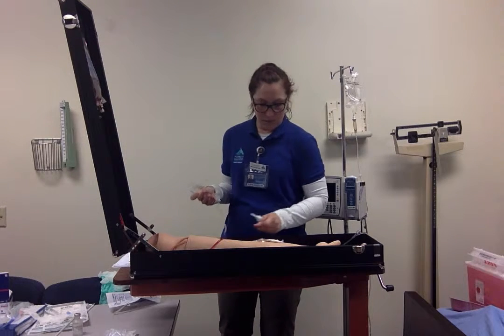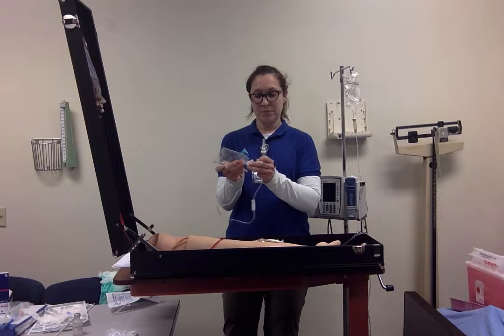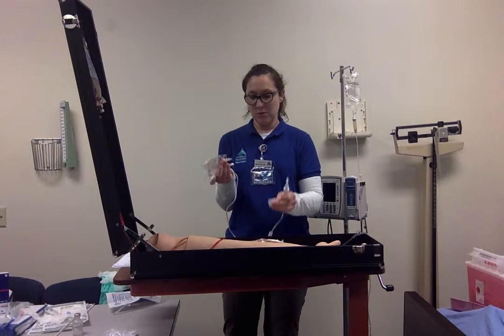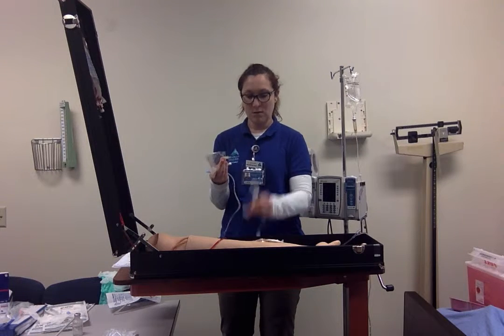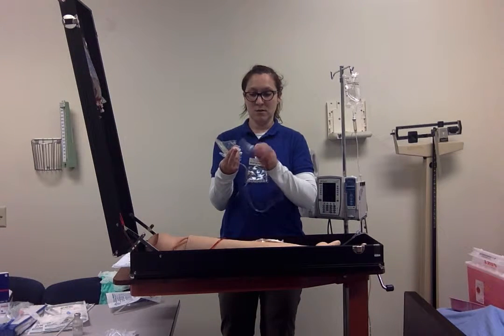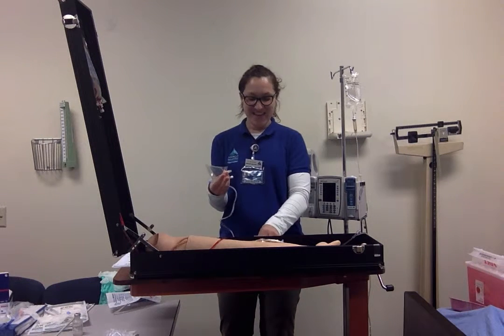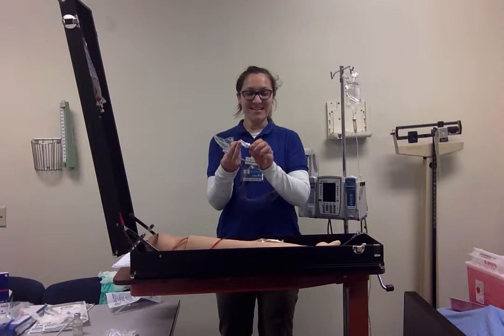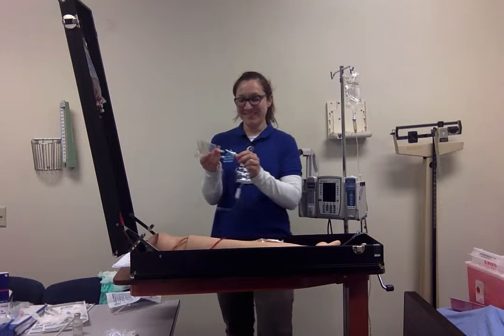Okay, once again, I'm going to prepare the bag, getting a clean alcohol swab, disconnecting the little blue cap, cleaning that with a clean alcohol swab, cleaning this, taking off the cap and cleaning it again, and rubbing my fingers all over it, cleaning it one more time. Okay.